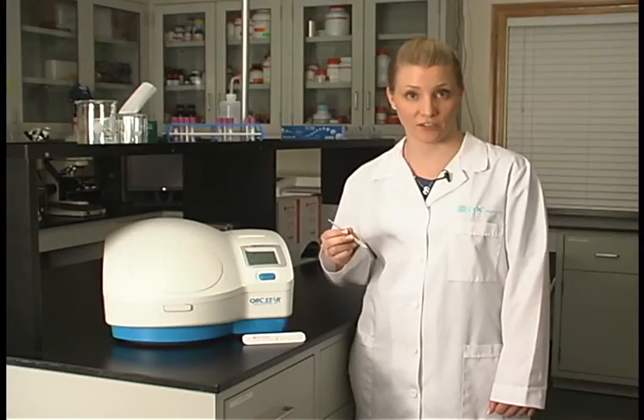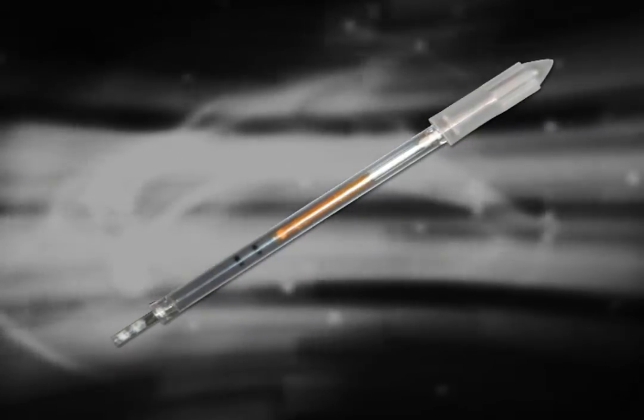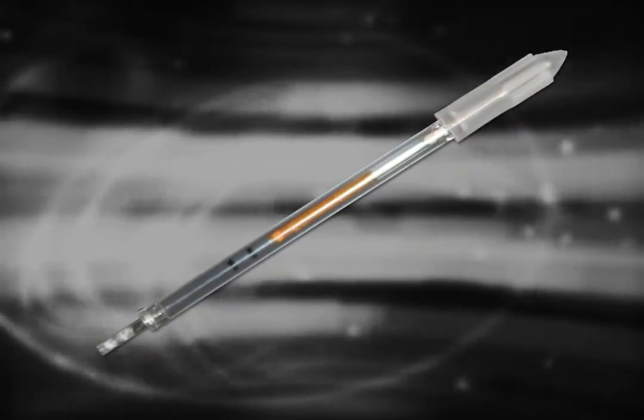You will be collecting your patient samples into the specialized QBC STAR tube. This tube can be used for venous or capillary samples. The STAR tube is internally coated with all the necessary reagents to perform a CBC.